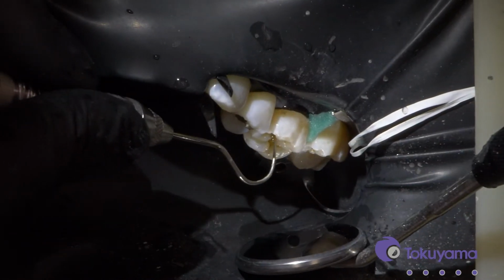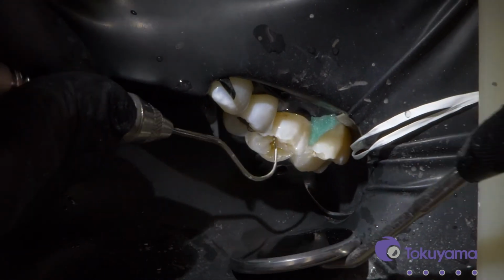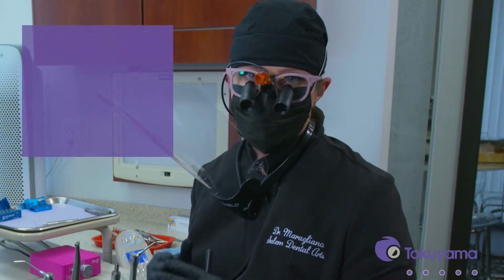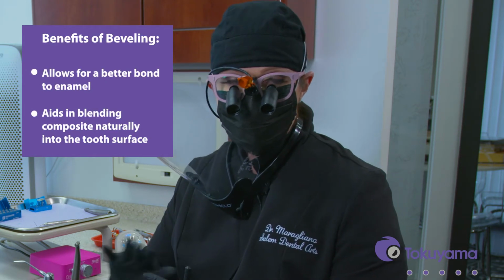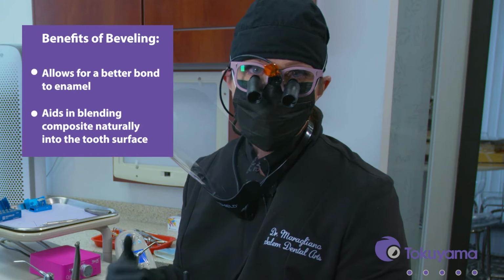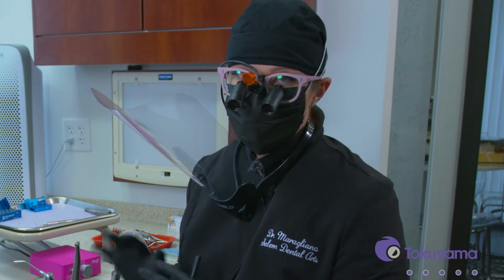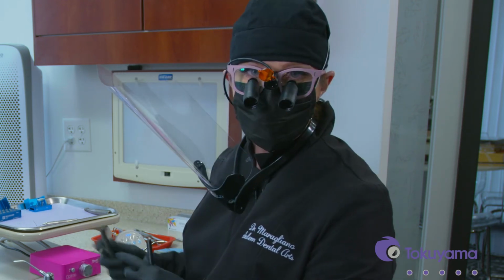All right, so our preparation is near complete. All of the caries have been removed. Amalgam is gone. Now the one thing left to do before we start restoring is bevel. I like to bevel my enamel margins for a few reasons. Number one, it allows me to adapt my composite more nicely to the tooth. I also am a huge fan, which we all are, of enamel bonding. So the more enamel that we bond to, the better longevity of a restoration that we'll get. So blending, aesthetics, and bonding, definitely try to get a good enamel bond. And I do that with a bevel.